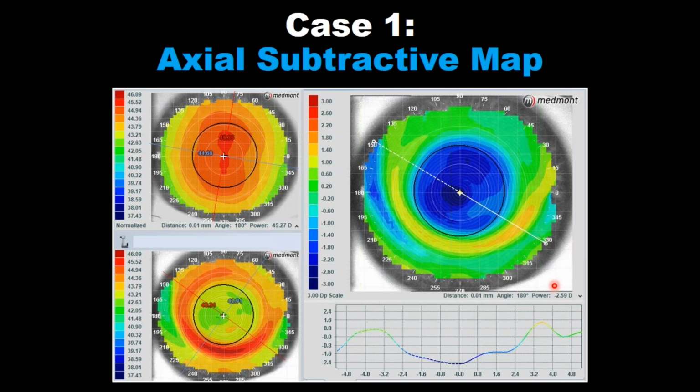Now the last thing that we wanted to discuss with you today was the consideration of myopia control and its application. Throughout the world, orthokeratology is being used as one of those optical interventions to try to control axial growth. And just doing a centered Ortho-k lens may not be the whole story. We need to look at how we distribute power across the surface and how that might contribute to a quality or optimal myopia control situation.